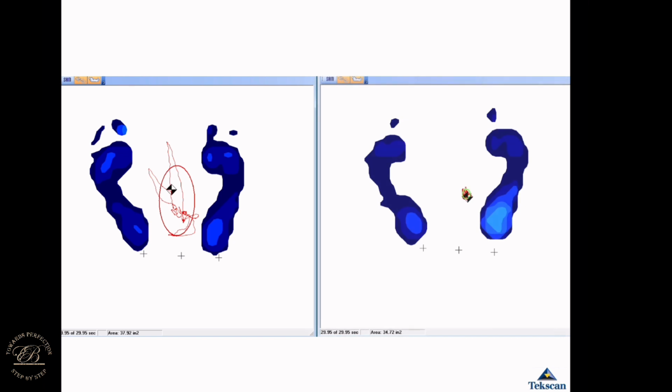Regarding the floating sensation, I actually did a MAT scan on the patient as well. A MAT scan is more or less a plate that works the same way as the T-scan does. You just stand on it on your feet, and it captures your pressure points on the feet and the movement if you have any. So this is actually before treatment, and this is right after. I didn't even have to say to him that it looks great. He could actually feel it the second that he opened his eyes again, saying that this floating sensation that he had was actually gone.